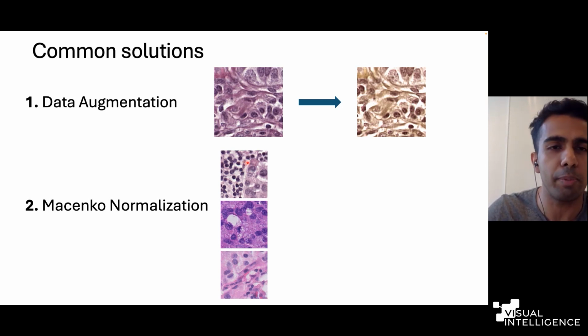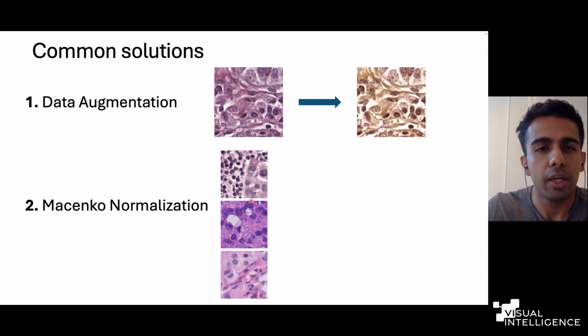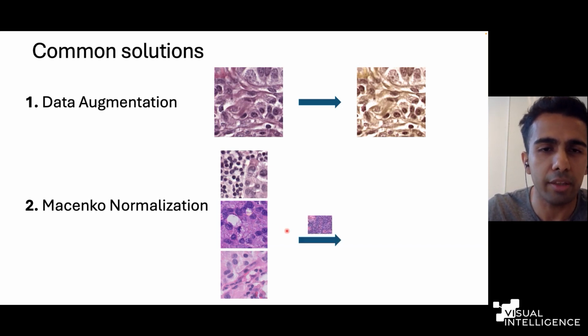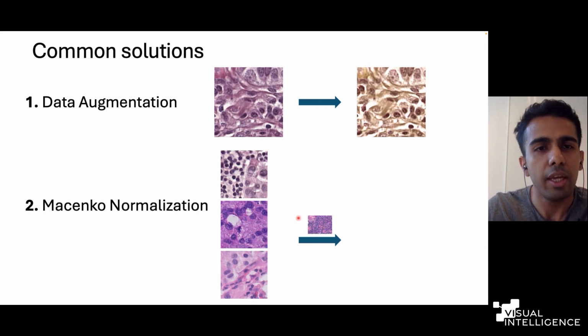And of course, there's going to be a mixture of these stains for stuff that doesn't fall in either of the categories. Okay, so what stain normalization tries to do is extract these two stain vectors mathematically from a given tile. So you pick one target tile, and then you try to project these colors back onto the same stain. So you basically change the color of all the rest so that they all look the same.